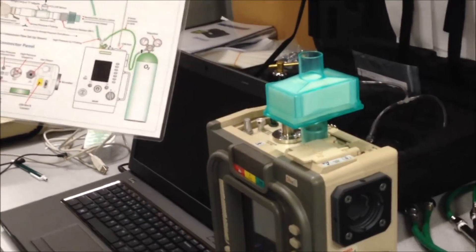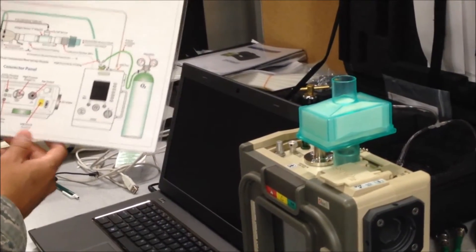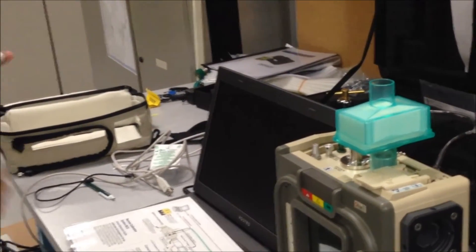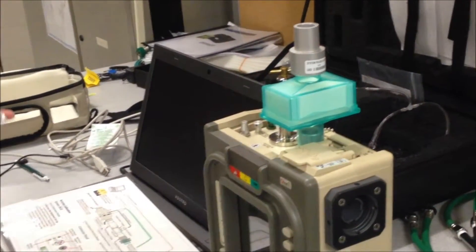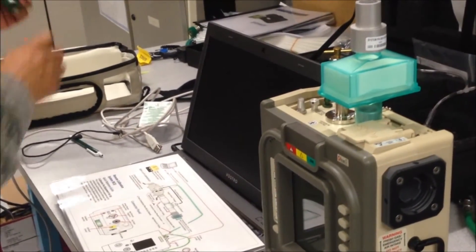Connect calibration resistor 1 and the airway pressure tubing.